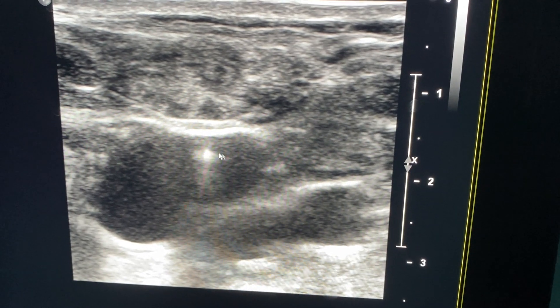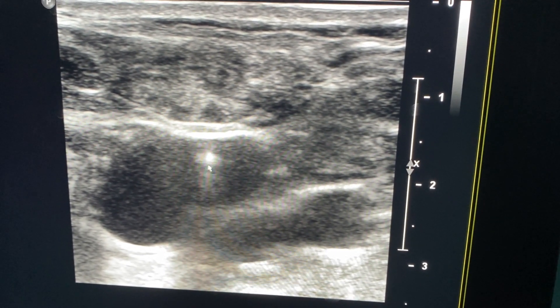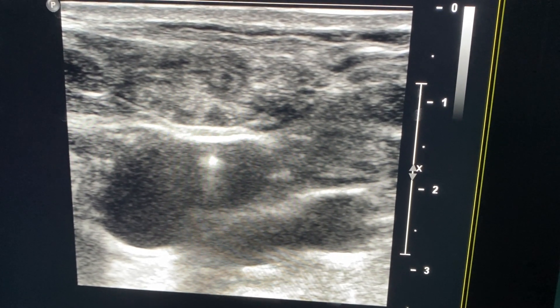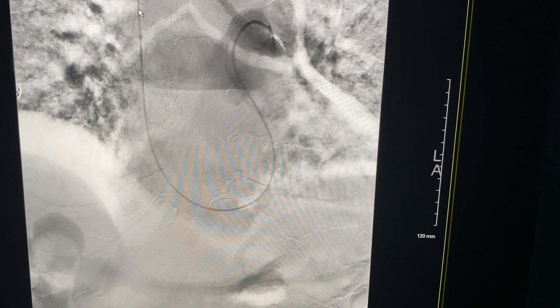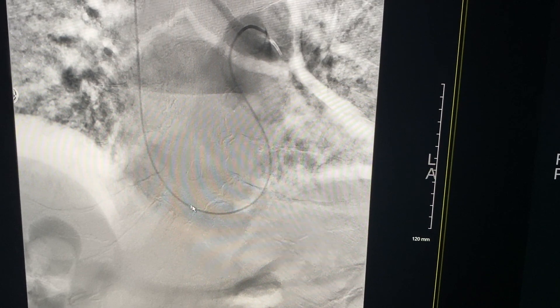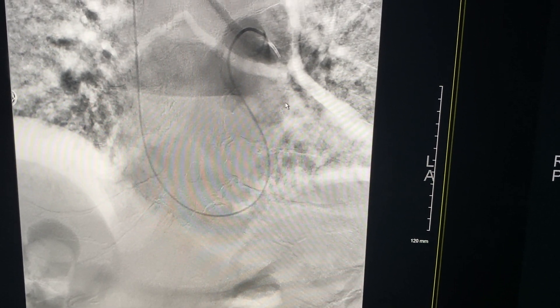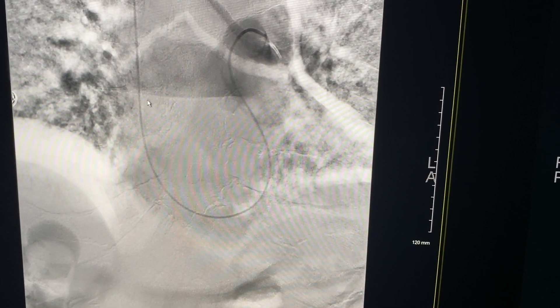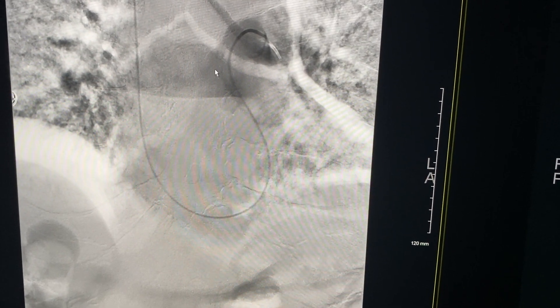This is one of the first images from the procedure. Here is one of the big vessels, and here's our needle actually entering into the vessel — that's how we gain access into the heart. And here, if we take a look, we've got our wire in. In real time, this wire is actually going into the heart, looping around the right side of the heart. This is the right side, this is the left side, and this is your airway splitting here.